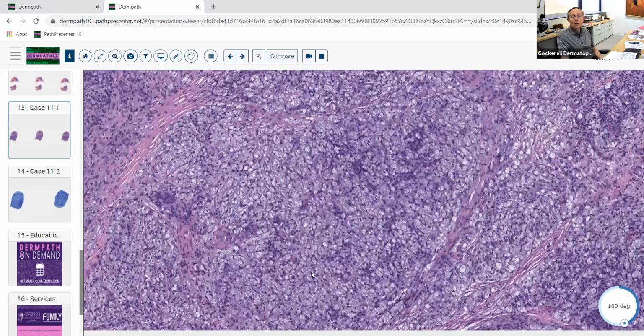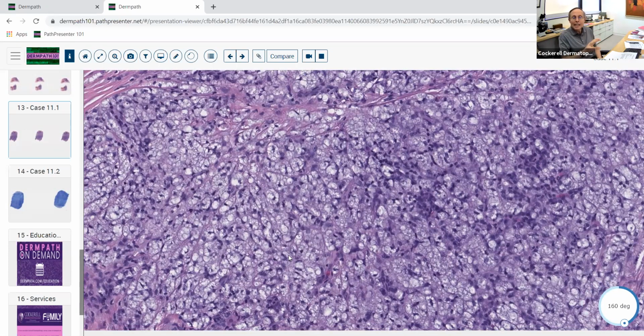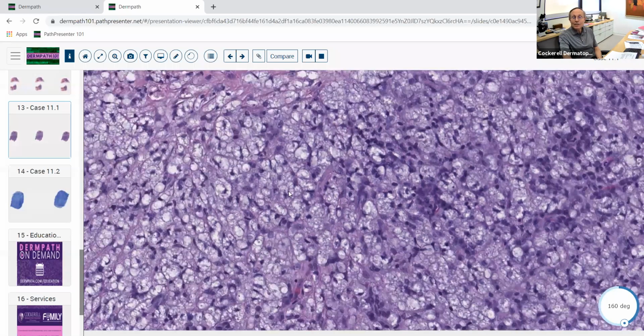And in this situation, you start looking at the histiocytes themselves, and they have a very clear staining cytoplasm. Once again, histiocytes tend to have abundant cytoplasm. Well, this one's got massive amounts of clear cytoplasm. It's got some kind of almost granular bluish gray morphology to what's sitting inside these individual histiocytes. They're filled with lipid, and this isn't just cholesterol or triglyceride inside these cells. These are actually lipid-laden microorganisms. And when you get this many cells like this, these are the so-called Virchow cells of leprosy or Hansen's disease.